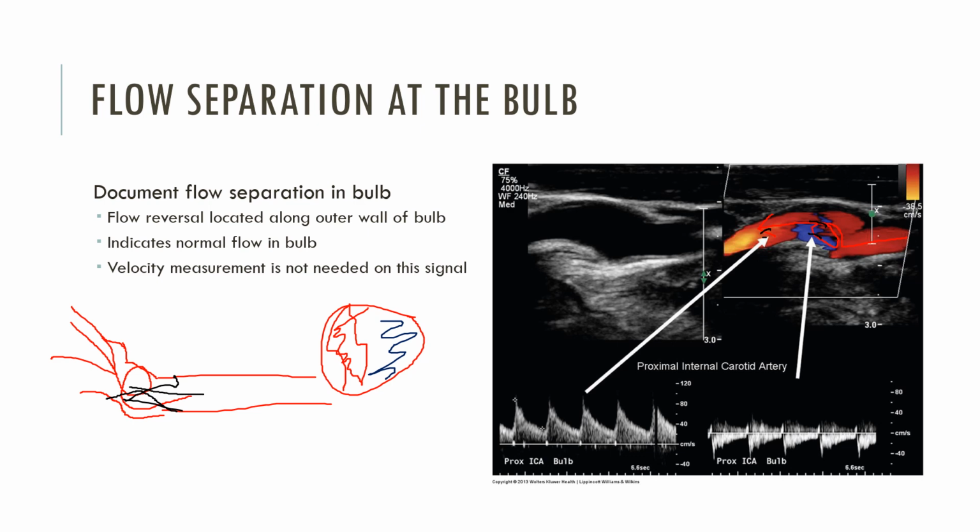And if we look at the flow coming into our bifurcation, this is one of the places that blood is going to be crashing into that wall before going down the actual ECA and ICA. Because of that added impact at the bifurcation, we're more likely to get damage to the tunica intima, and on that damage we can accumulate plaques. So this is one of the first places plaques will start to show up, and looking for this normal flow separation can be very helpful in assessing whether there are plaques there, or plaques that are at least hemodynamically significant. We would find those there.